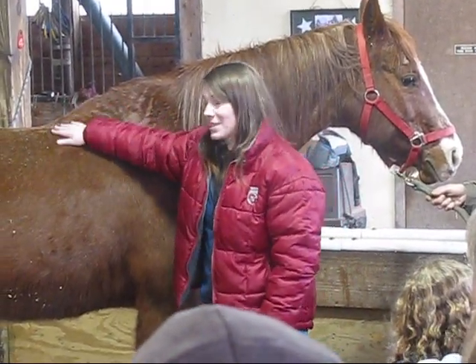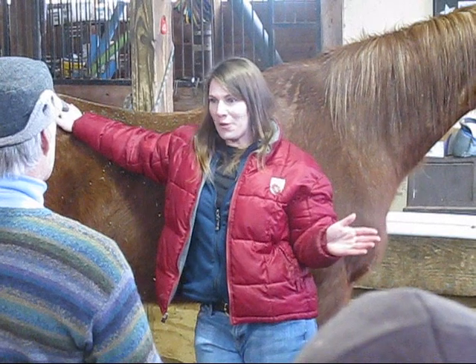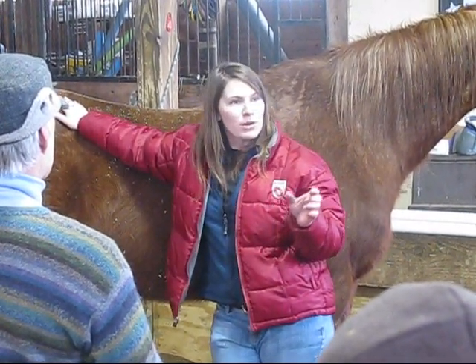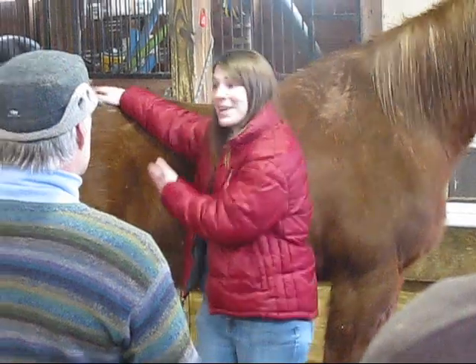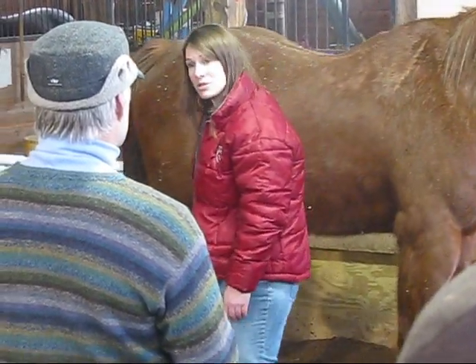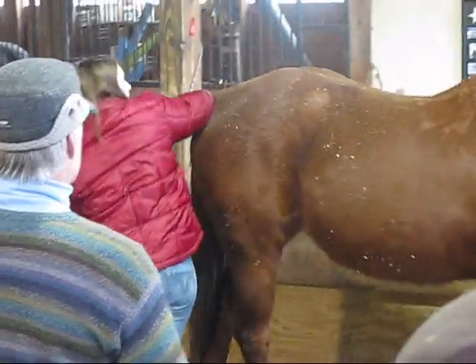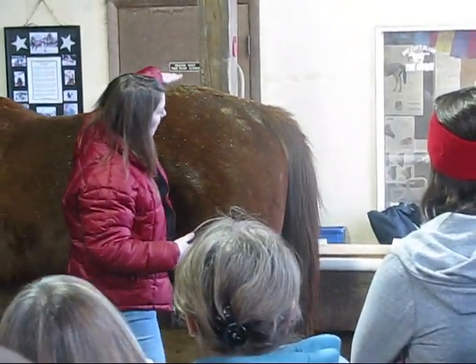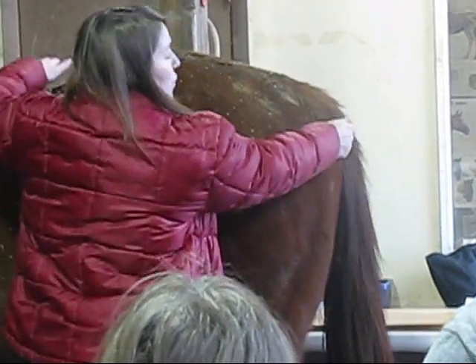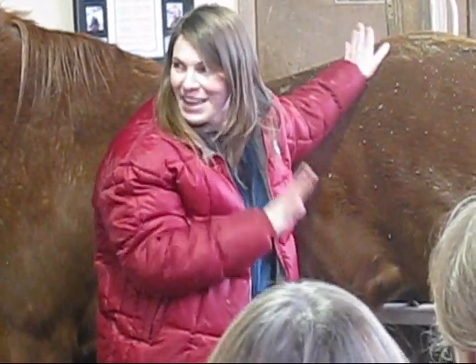Now we're going to get a temperature. Safety is always, always important. Taking temperature means standing behind the horse, and you guys who've been around here know it's not usually good to stand directly behind a horse. Thermometers are tiny — it's amazing to think a tiny little thermometer would bother them, but some horses do get sensitive. So move their tail to the side, get the thermometer in, and wait until it beeps or it's been a minute, depending on whether you have a mercury or digital thermometer. Digital ones are great, especially the quick ones — less time back there keeps you safe.